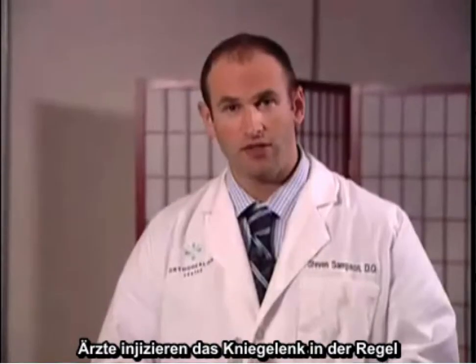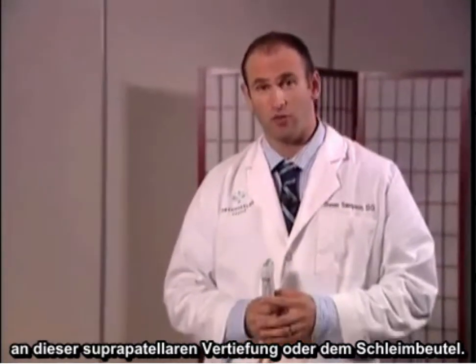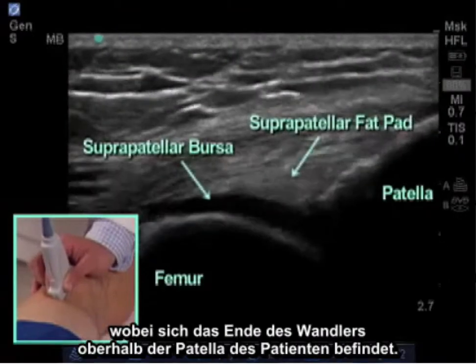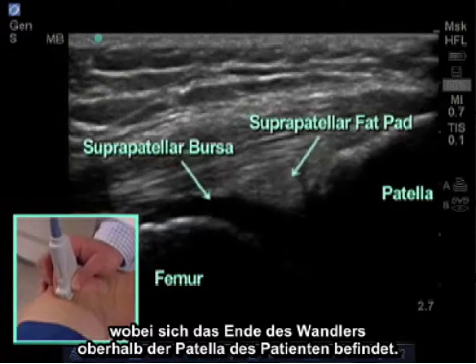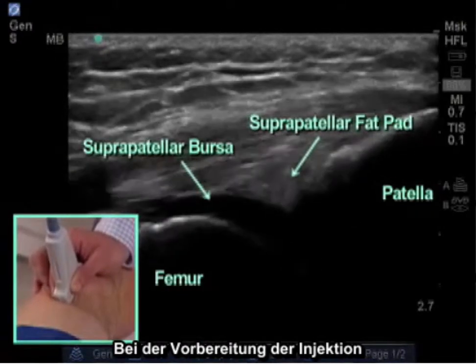The most common target that physicians typically inject is the knee joint's suprapatellar recess or bursa. We begin by placing the transducer in a longitudinal plane with the end of the transducer just above the patient's patella.